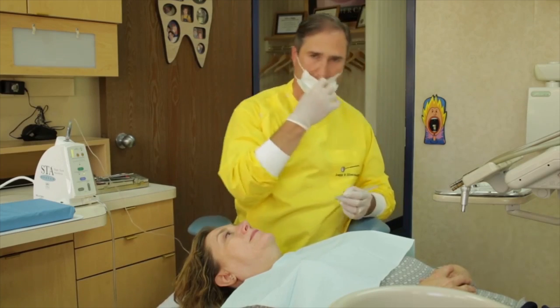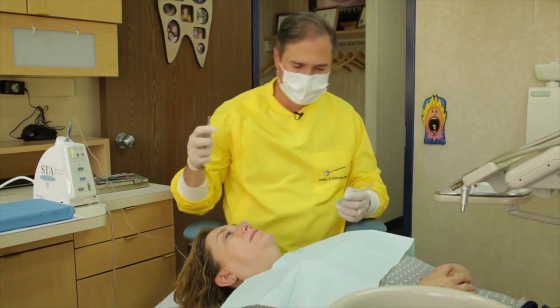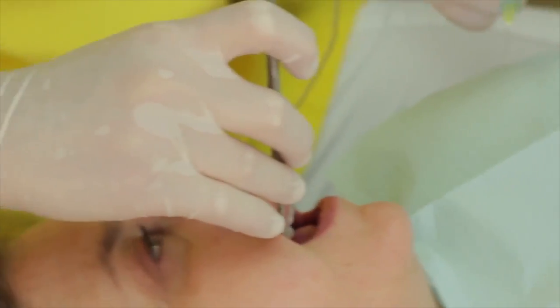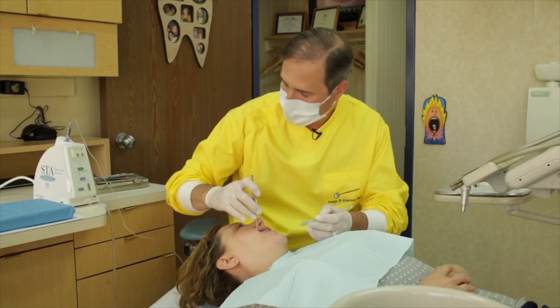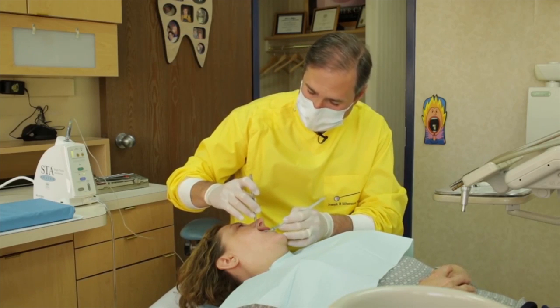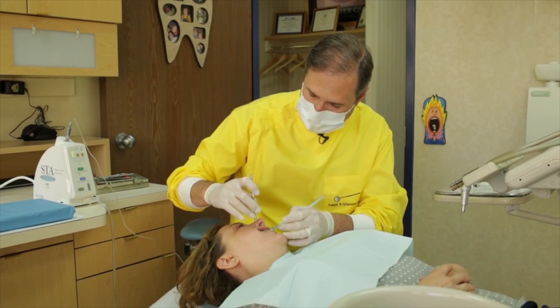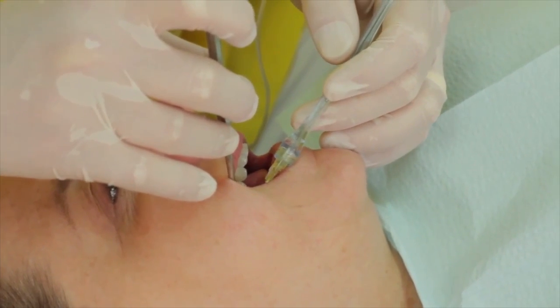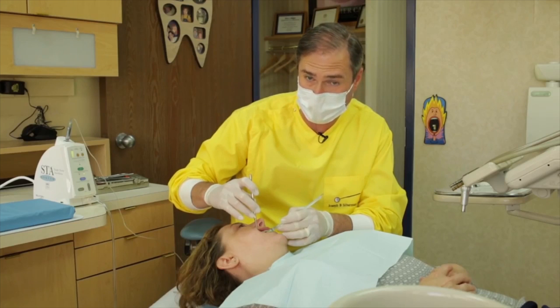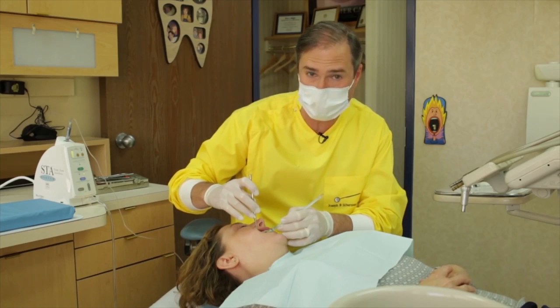We take this patient's lip, and in this situation I'm going to make an upper right back tooth numb. We start the flow of the anesthetic, and I start it by using my foot pedal. That beeping is the anesthetic going through the needle tip one drop at a time. I'm actually through the tissue without any pain for the patient.